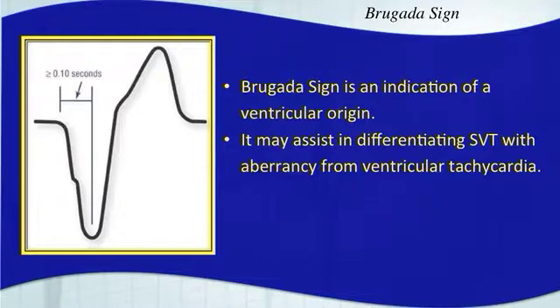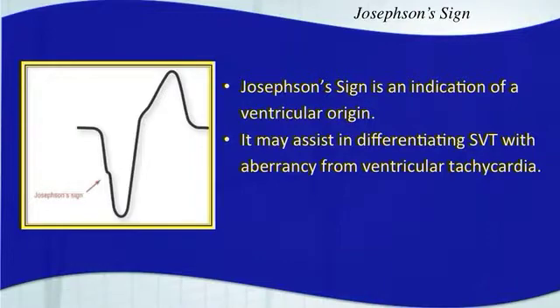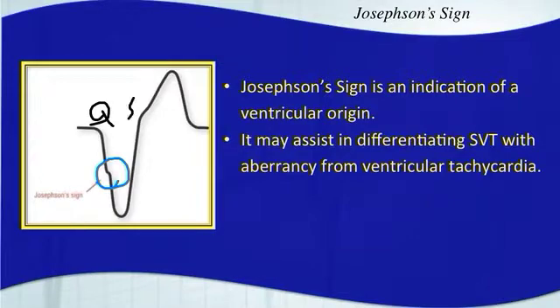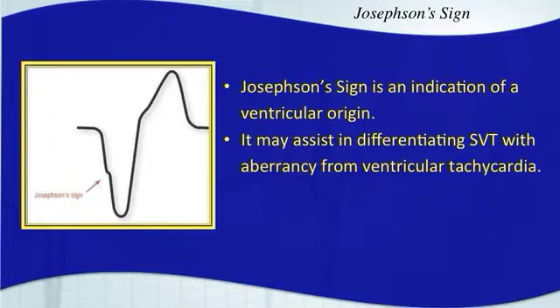You also have Josephson sign. Unlike Brugada sign, Josephson sign is an actual physical finding you see on the EKG — that little notch within the downslope of the QS complex. You'll see that this wave is a QS wave because it has no positive deflection. On the very first part of the intrinsicoid deflection, you have that little notch, and that makes it highly suggestive of a ventricular origin.